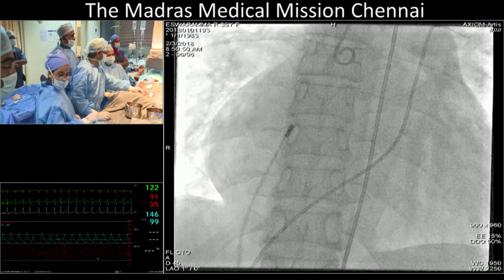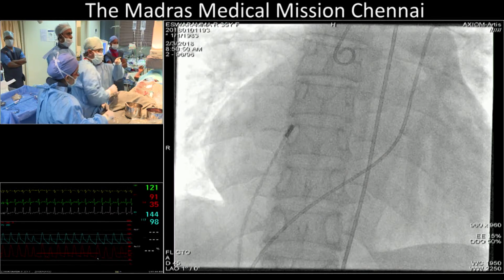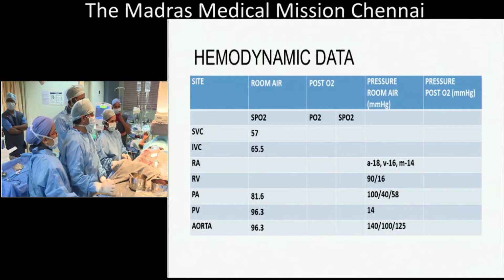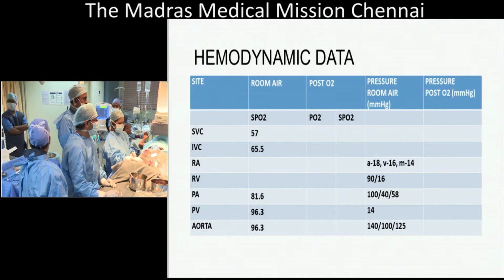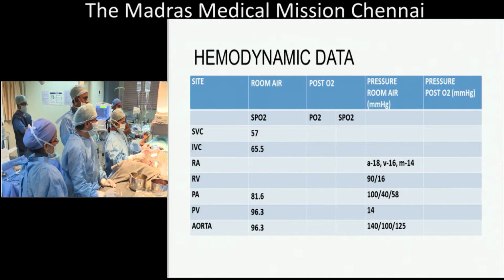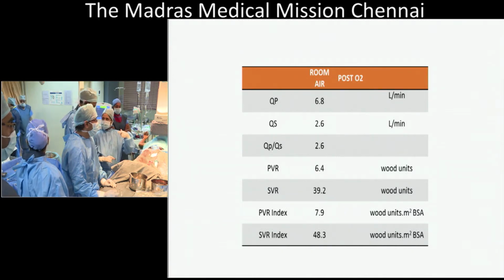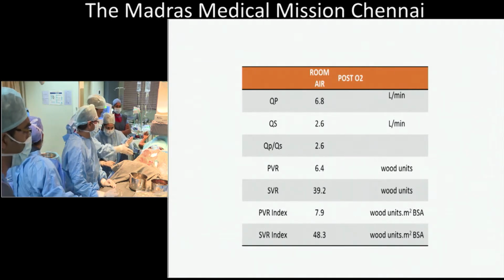I think as far as this patient is concerned, I'm quite optimistic. Given that the baseline shunt is so good, the pulmonary artery diastolic pressure is just 40, and the mean pressure ratio is almost 2.5:1, I would be happy just closing this ASD and starting the patient on pulmonary vasodilators. So you wouldn't do a balloon occlusion test? No, I don't think that in this case I would consider doing anything. Okay, looks good to me.